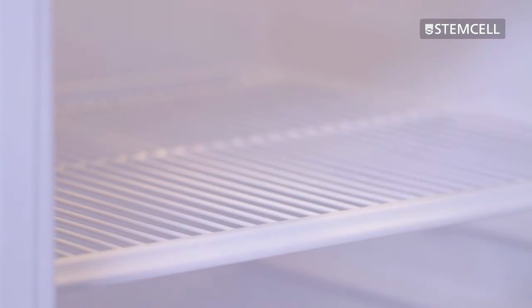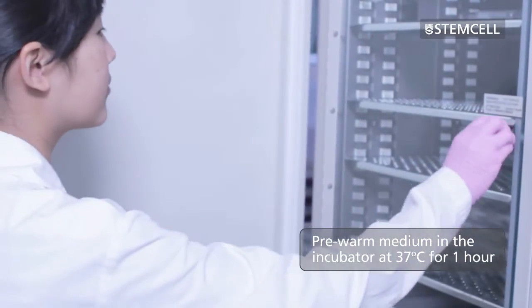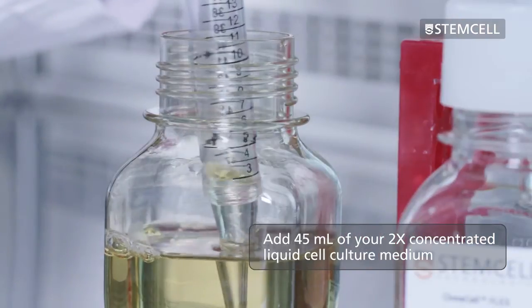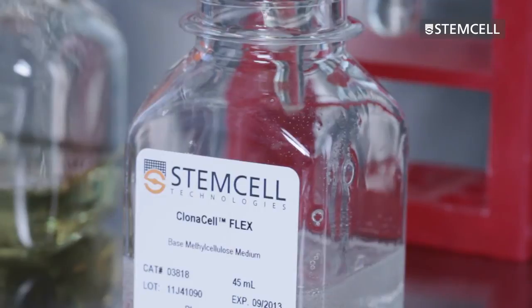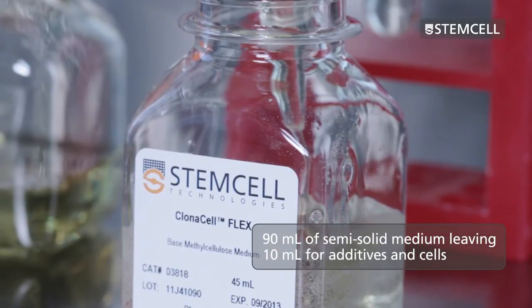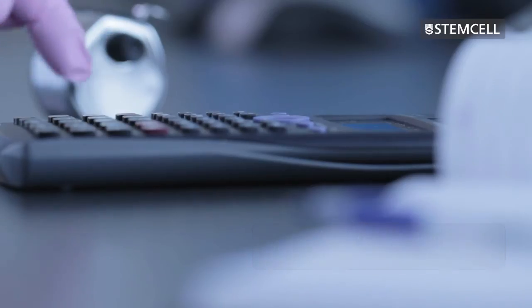To prepare the semi-solid medium, first remove the 45 milliliter bottle from the refrigerator. Place the bottle in an incubator at 37 degrees Celsius and pre-warm the medium. Add 45 milliliters of your 2x concentrated liquid cell culture medium — this medium should be specific to the cell type and selection system you're using. Your bottle should now contain 90 milliliters of semi-solid medium, leaving a total volume of 10 milliliters for additives and cells.